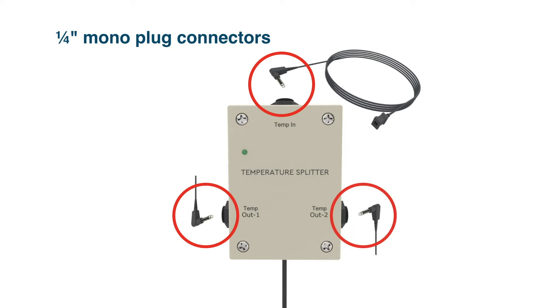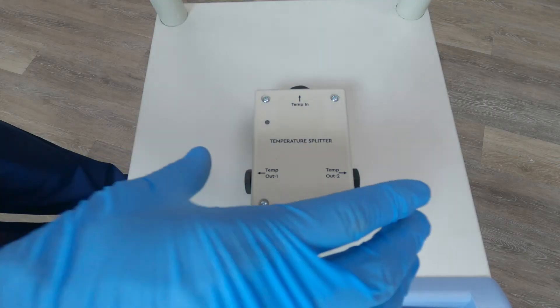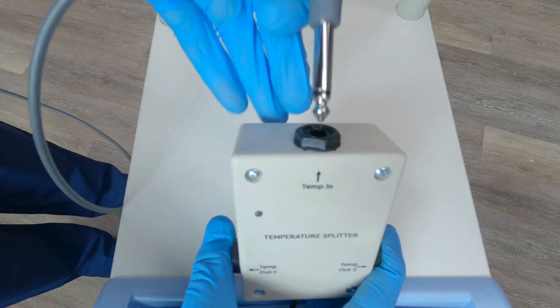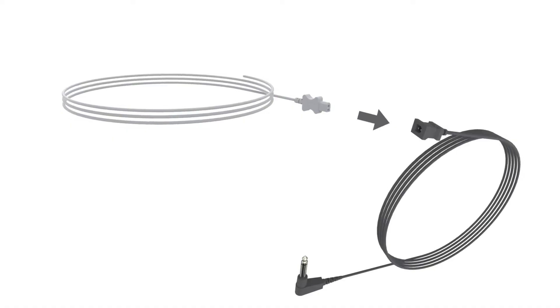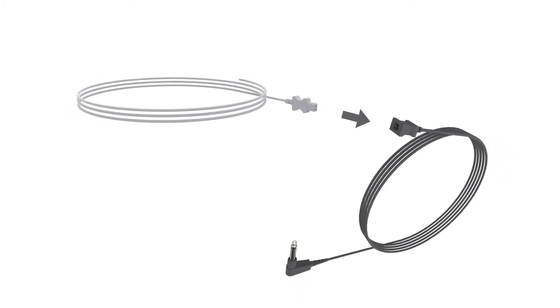Let's review how to set up the Temperature Splitter. First, connect a patient's core adapter cable to the temp-in input at the top. Now, connect the disposable core probe and insert the probe into your patient.